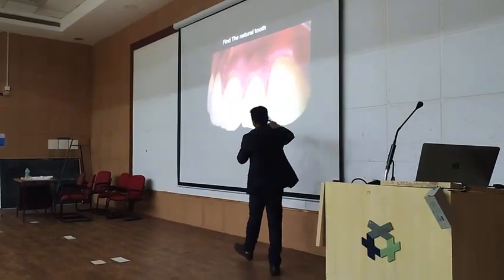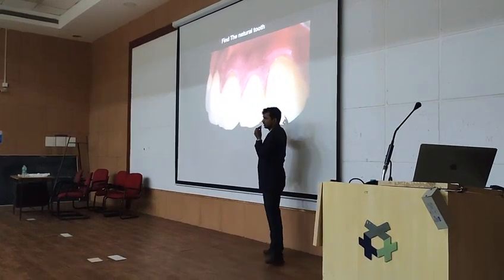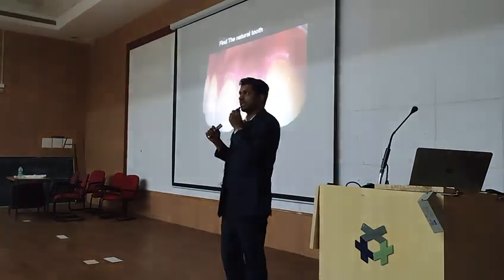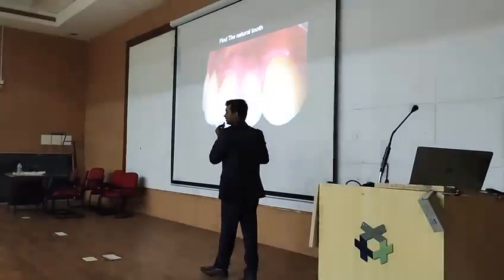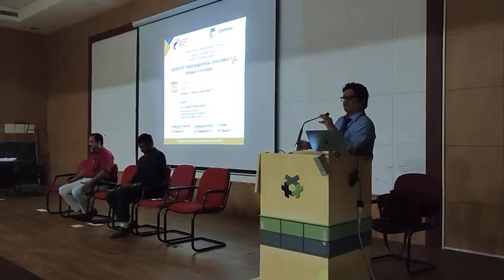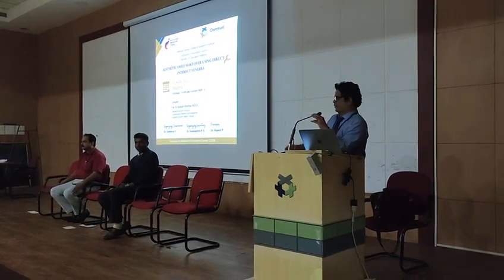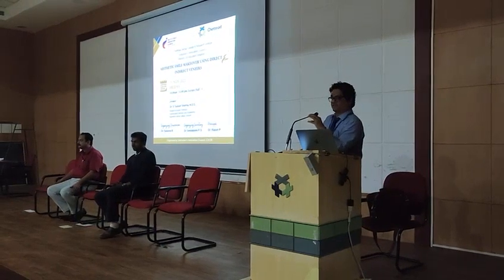which we did as veneers, and this canine is along a crown. Okay, so only with the glass ceramics we can attain this kind of results. Okay, and have opportunities. So pathfinding opportunities, both for the patient and for us.